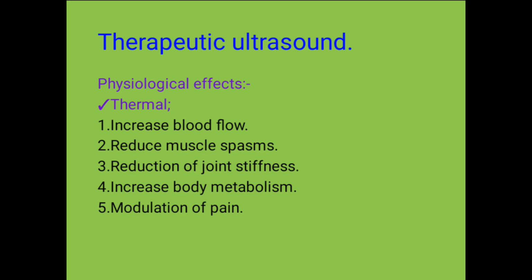I want us now to look at the physiological effects. Physiological effects are grouped into two: the thermal and non-thermal. And if you have a good memory, there is somewhere we mentioned the non-thermal. So if you can remember, keep it in mind. We are going to handle it in a little while.